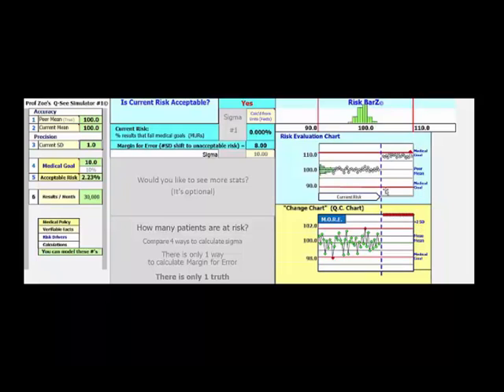After this blue line, I've simulated a shift to unacceptable risk. After the blue line, one of the 20 results afterwards exceeds the allowable error limit. That means 5% of the results are clinically unacceptable. What we're seeing on this QC chart is exactly what people think they always see, that shift in the mean would be noticed immediately. But watch what happens as the gap between where you are now and where you would be if the method failed becomes smaller.